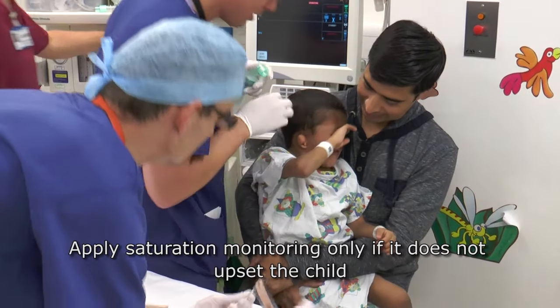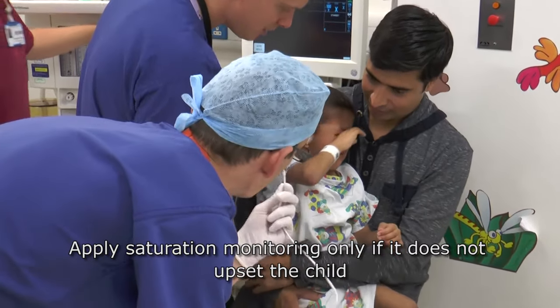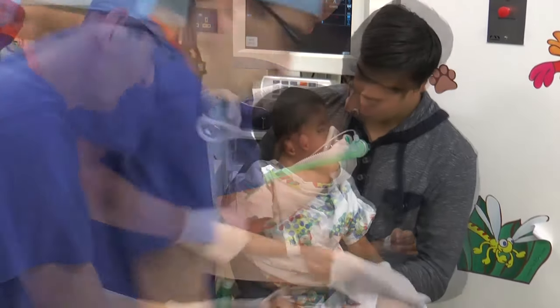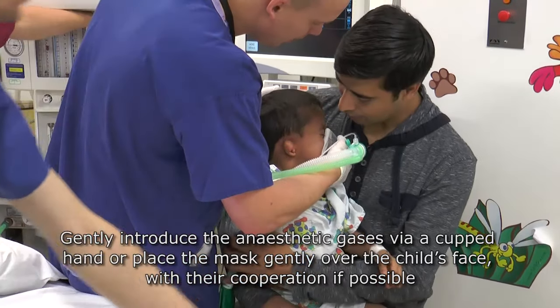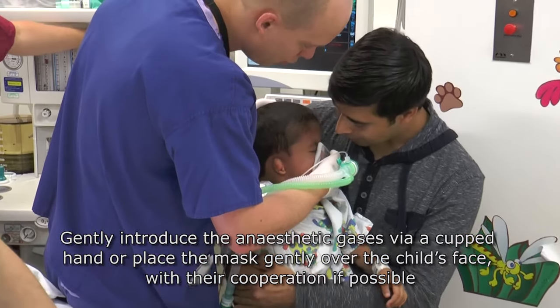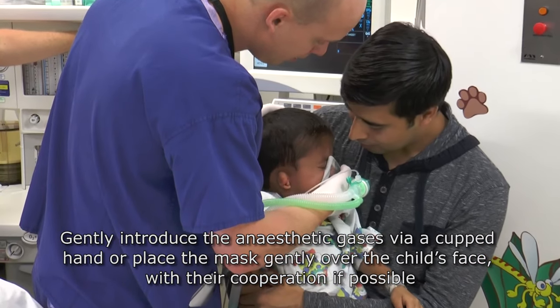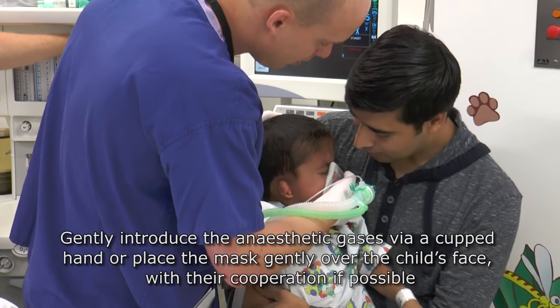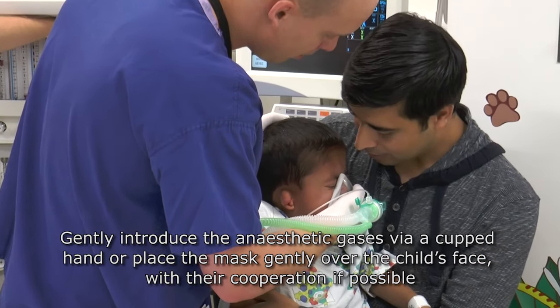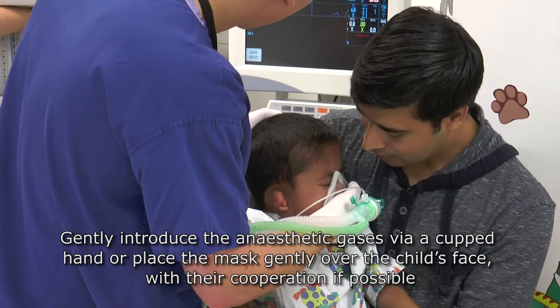Apply saturation monitoring only if it does not upset the child. Gently introduce the anaesthetic gases via a cupped hand, or place the mask gently over the child's face with their cooperation if possible.